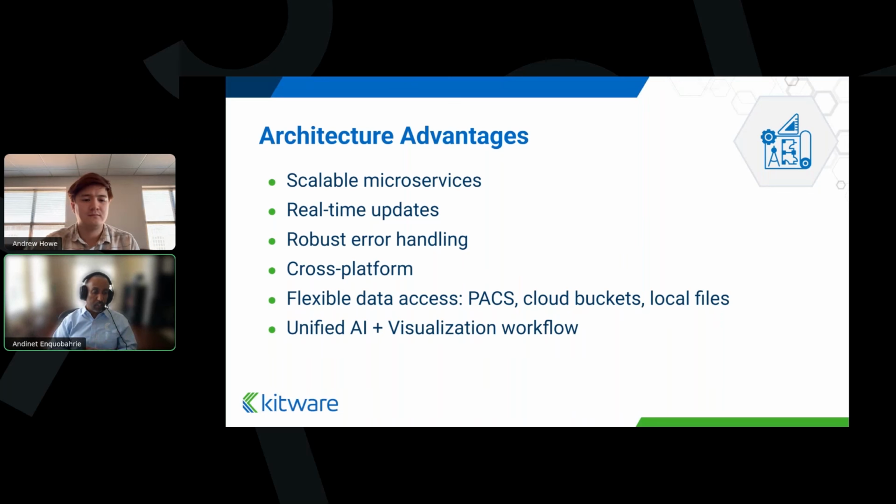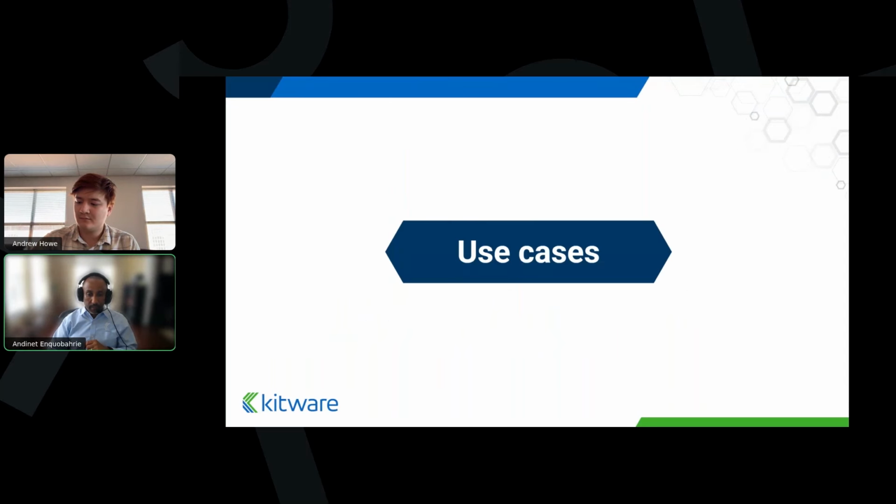Again, at the end, just in summary, the VolView architecture allows you to have this unified system of AI, visualization, and data handling. All right. So next, I'll just quickly go over some of the use cases, and then I'm going to hand it over to Andrew to see the demo, which is actually obviously the more exciting part of the webinar.